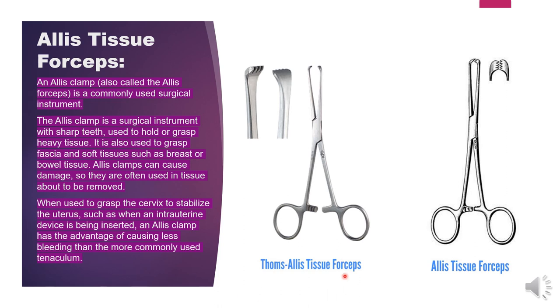When used to grasp the cervix to stabilize the uterus — such as when an intrauterine device is being inserted — an Allis clamp has the advantage of causing less bleeding than the more commonly used tenaculum. This is the Allis clamp or Allis tissue forceps. It is crushing and applied on tough structures.